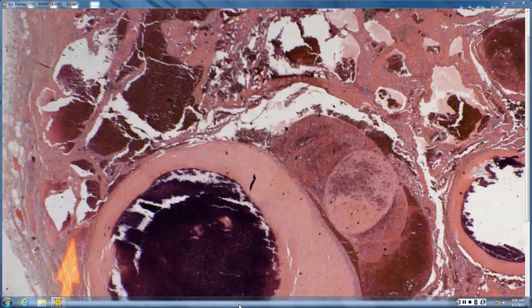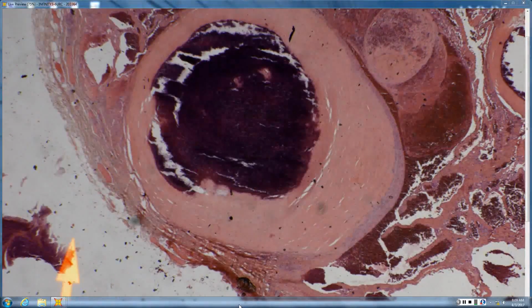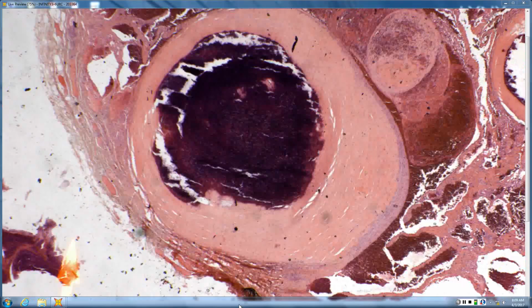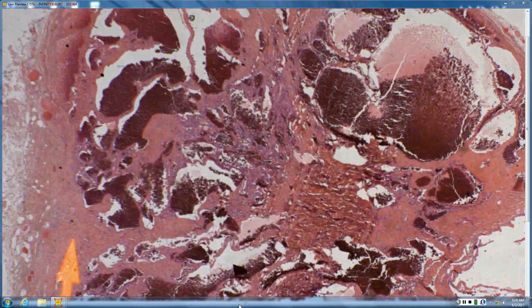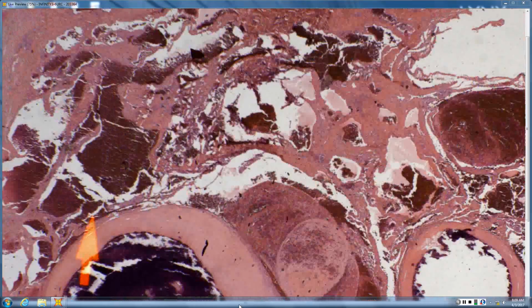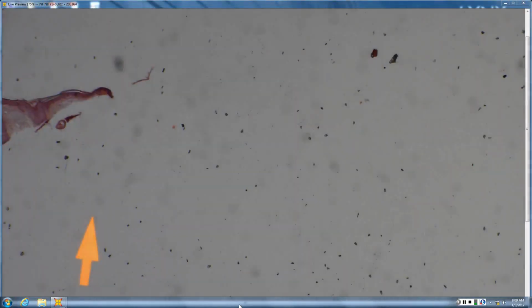Lots of thrombi. Yeah, and what's that big calcified pearl-like thing? Like a phlebolith, exactly. So you've got a big old phlebolith sitting in something that looks kind of like hemorrhagic lung, like a spindle cell hemangioendothelioma. So it looks like hemorrhagic lung, alveolar-like spaces. There are some solid spindle cell areas, and there are big old phleboliths. That would be a spindle cell hemangioendothelioma, also known as spindle cell hemangioma, because it's the one in that group that's benign.